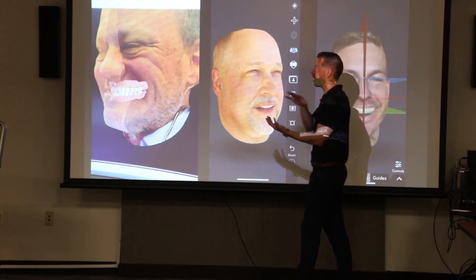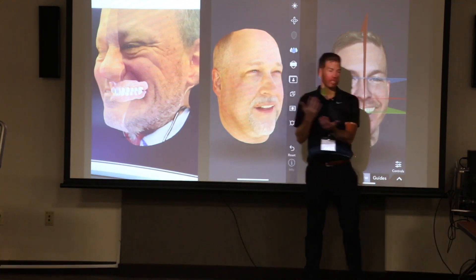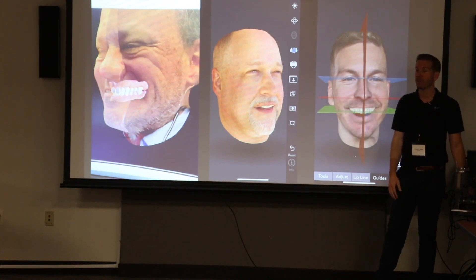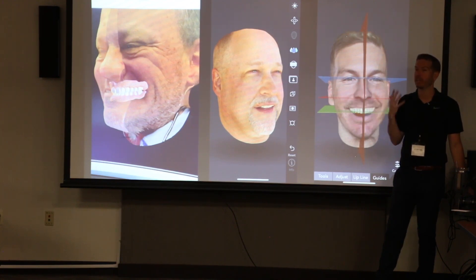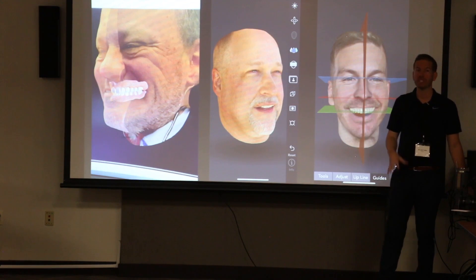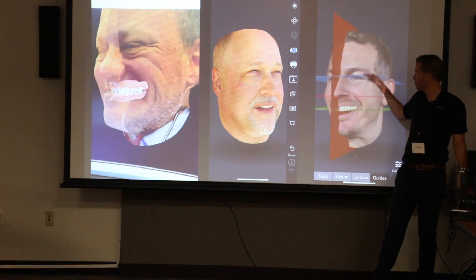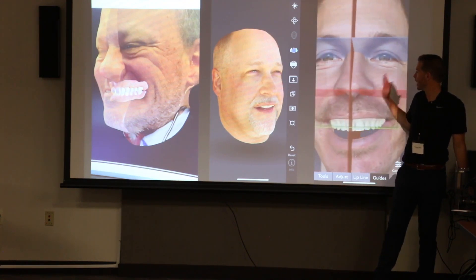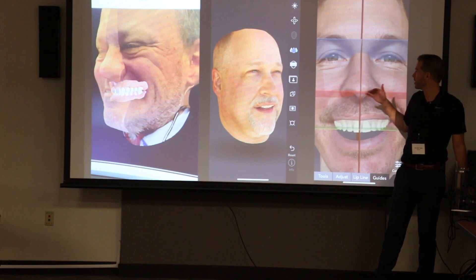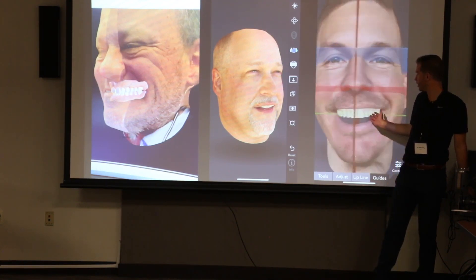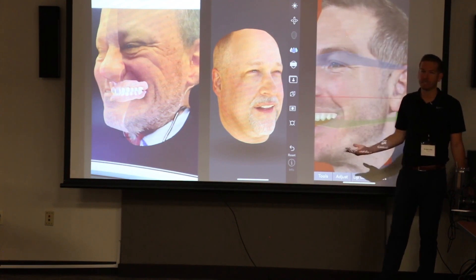When you bring these files in, you can make them translucent and turn on various layers, creating that digital patient. Whether you're using it for the wow factor — so patients understand every aspect of their situation — or using it for diagnosis, it's really cool. The pro version lets you get your occlusal plane, midlines, Camper's plane, and pupillary line to do all this treatment planning. I actually diagnosed myself as having a canted arch just based on this app, which I thought was pretty cool.